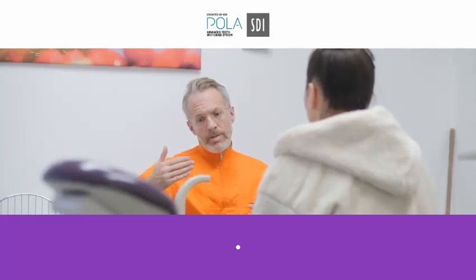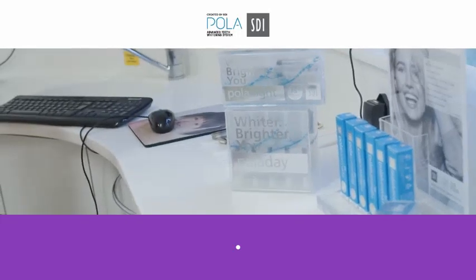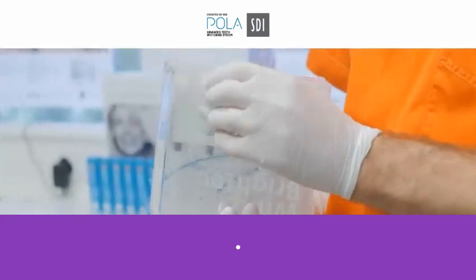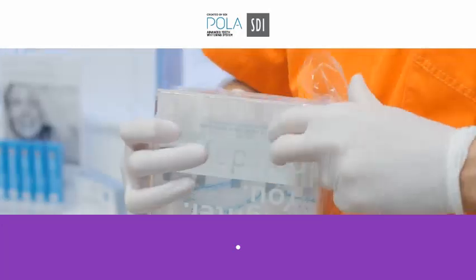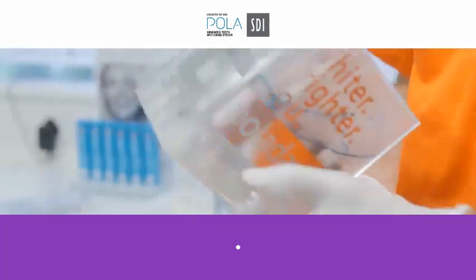So what generally happens then is the product we give you is probably about 6 to 8 weeks with whitening gels in the packs, but we also give you some top-up syringes, so you'll get about 10 syringes. And you'll keep those, and the best thing to do is keep them out of the children's reach and just keep them in the bathroom cabinet. They're stable to be kept in the bathroom, it's not a problem whatsoever.